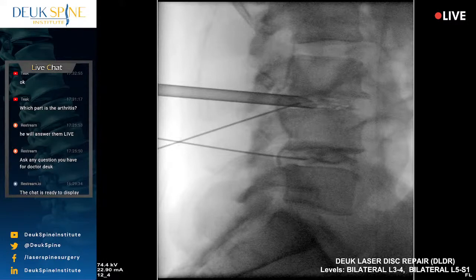Lateral, please. You're fine, just swing it. That's fine. Probably got to lower it a little more, but go ahead. There you go. Watch the scope. Watch the scope. Keep going, come on.